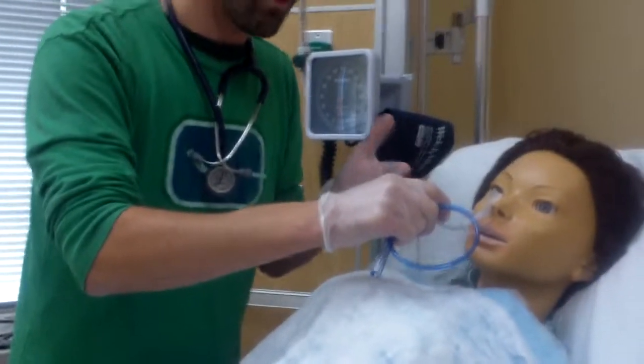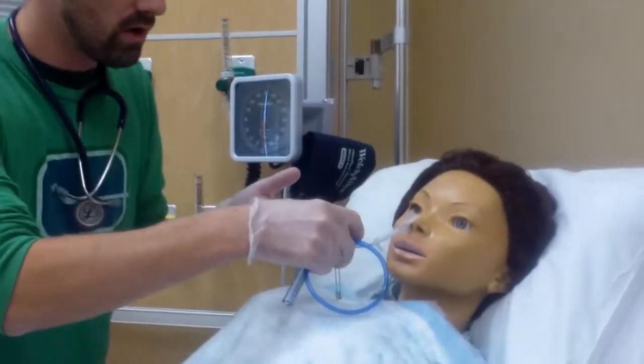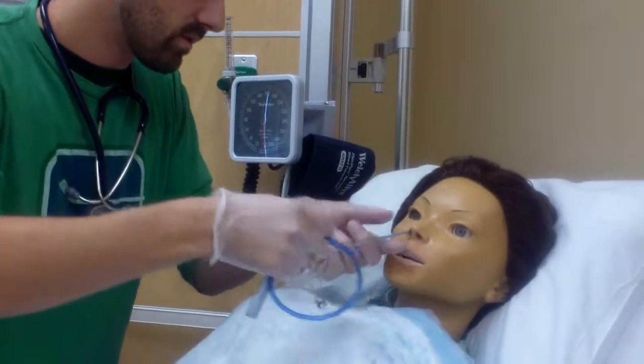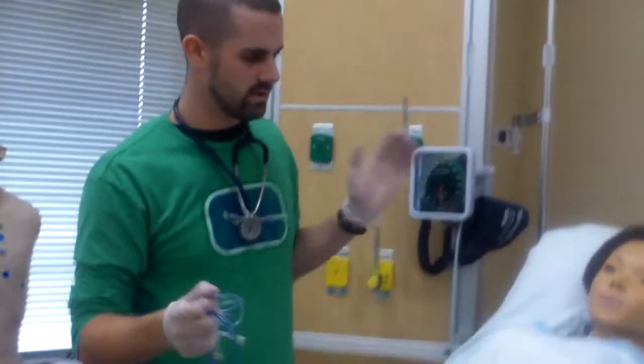I'm going to tell them to hold their breath so they don't aspirate. And I'm going to try to go as quickly as possible so I try not to tickle their gag reflex. So, okay, hold your breath. 1, 2, 3. I'm going to be coiling this around. Okay, you're doing good, doing good, doing good. We're almost there, and there we go. Okay, good. And good, they didn't throw up.